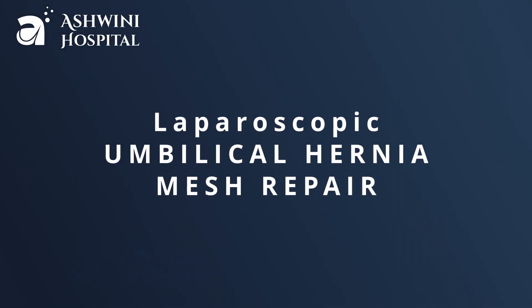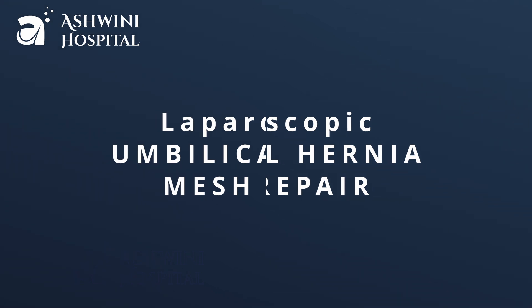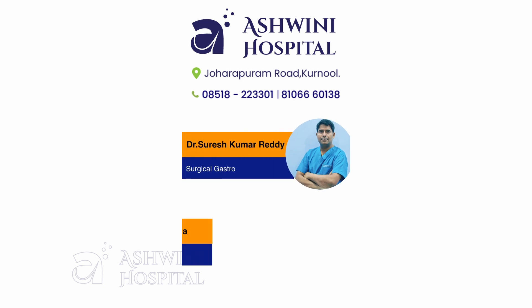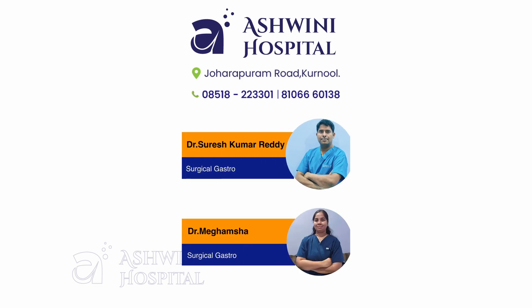Hello everyone. This is a short video of laparoscopic umbilical hernia mesh repair by IPOM technique. I am Dr. Suresh Kumar Reddy, consultant surgical gastroenterologist and advanced laparoscopic surgeon from Ashwini Hospital, Karnol.